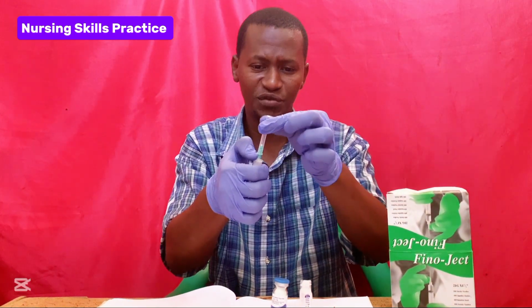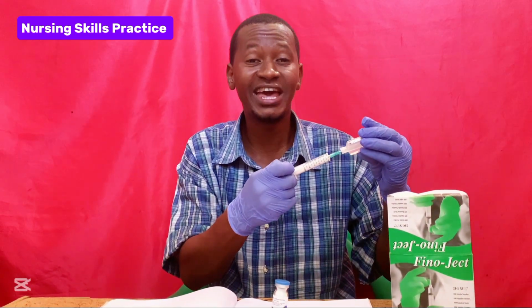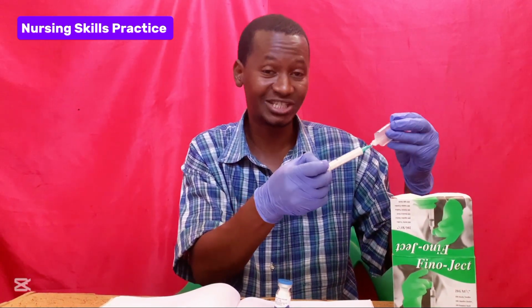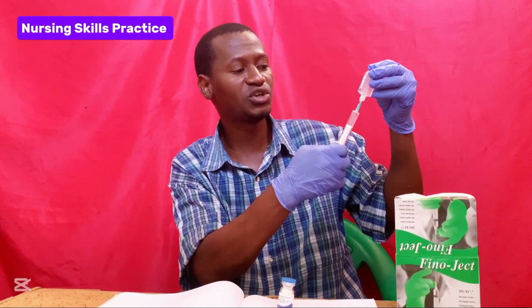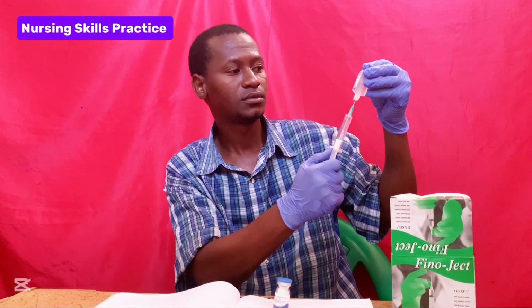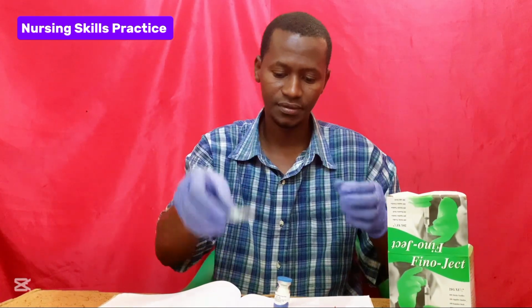You remove the cap of the needle. Then you withdraw the sterile water for injection. Now we are preparing the 1 gram powder for injection, so we have to withdraw 5 millilitres of sterile water for injection. When you finish, make sure you remove the air bubble. Then put back the cap of the needle.